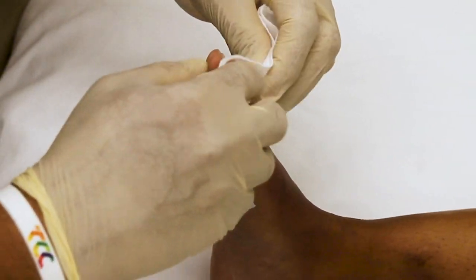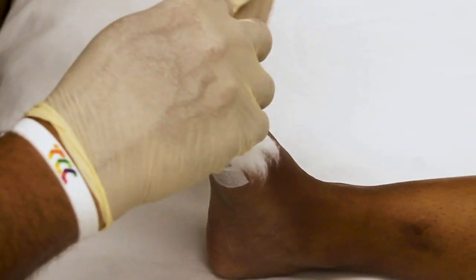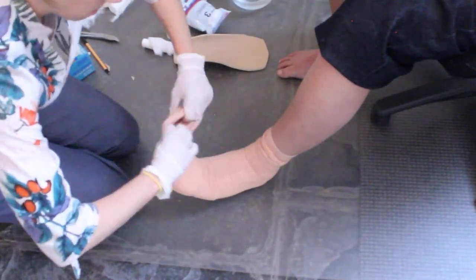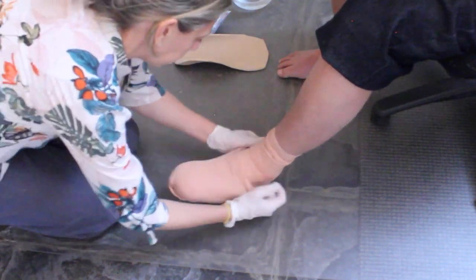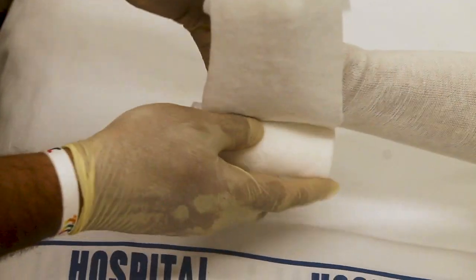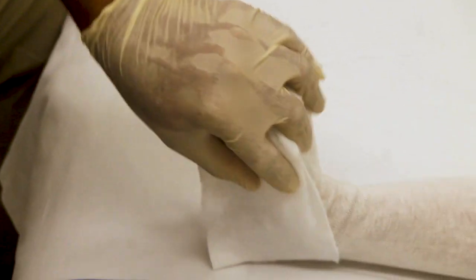Place soft band or cotton wool between the toes. Apply a single layer of stockinette. If you do not have access to a sewing machine, twist and overlap the stockinette. Apply padding to the toes with five to six layers of soft band. Hold the padding in place with one layer of soft band around the heel. Apply the second stockinette.